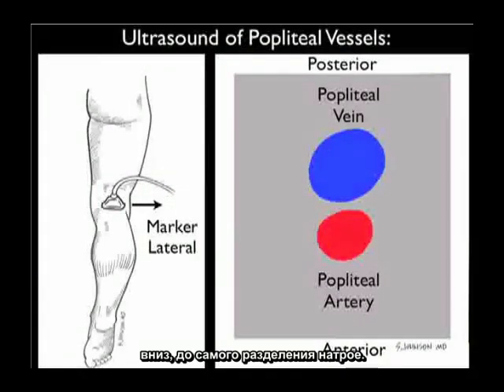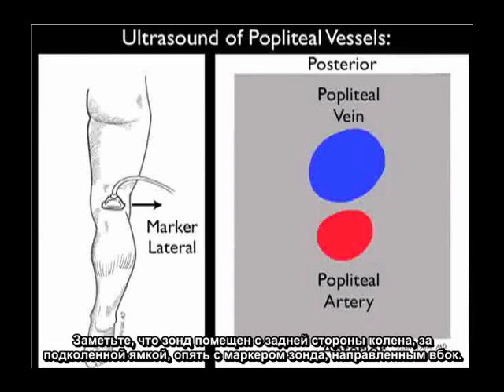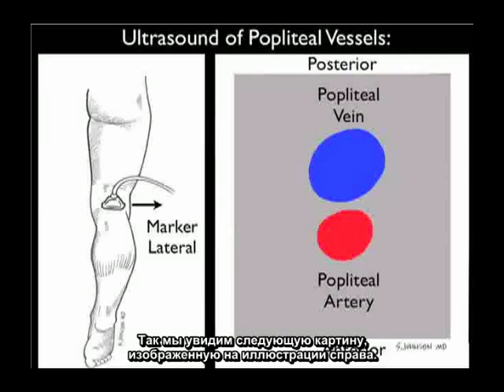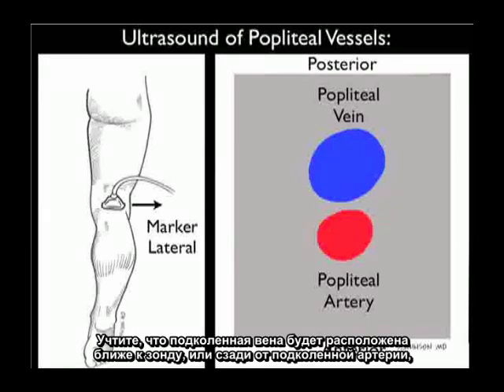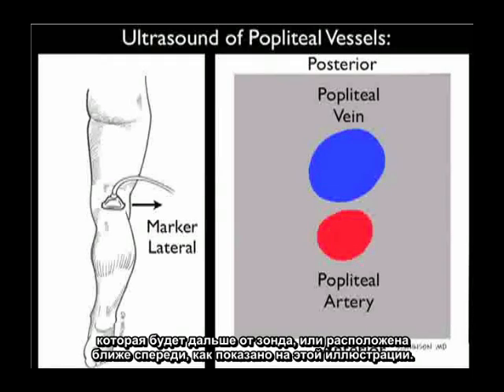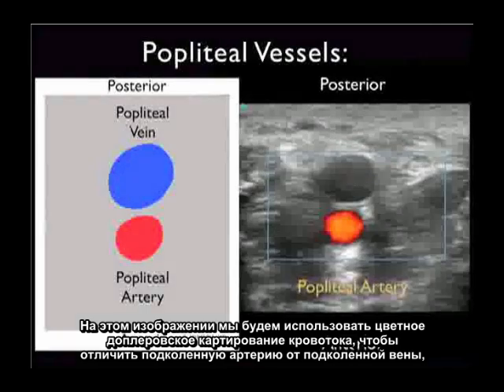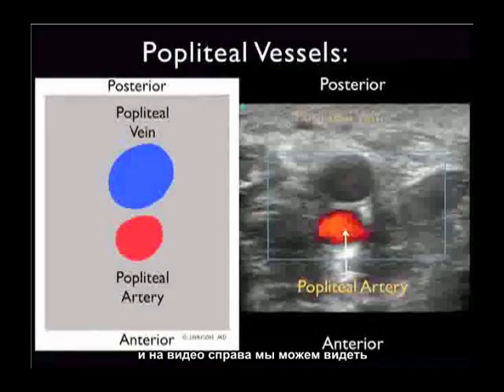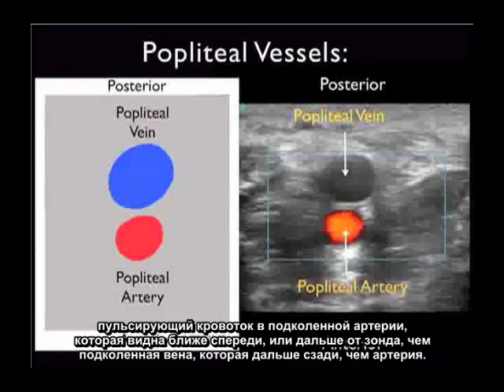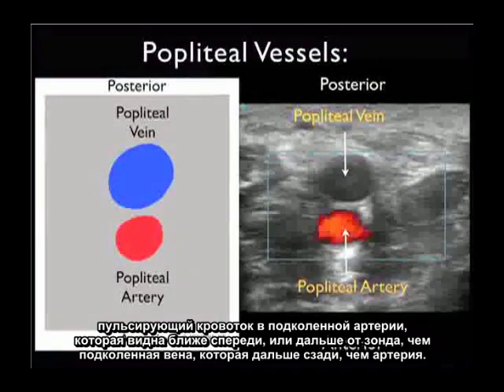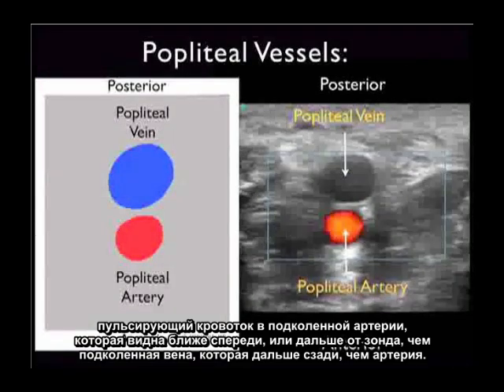With the probe placed into the posterior aspect of the knee within the popliteal fossa, marker dot oriented laterally, the popliteal vein will be located closer to the probe — posterior to the popliteal artery, which is further away or more anteriorly located. Using color flow Doppler, we can see the pulsatile flow of blood within the popliteal artery, anterior and further from the probe, and the popliteal vein seen more posteriorly with phasic flow.